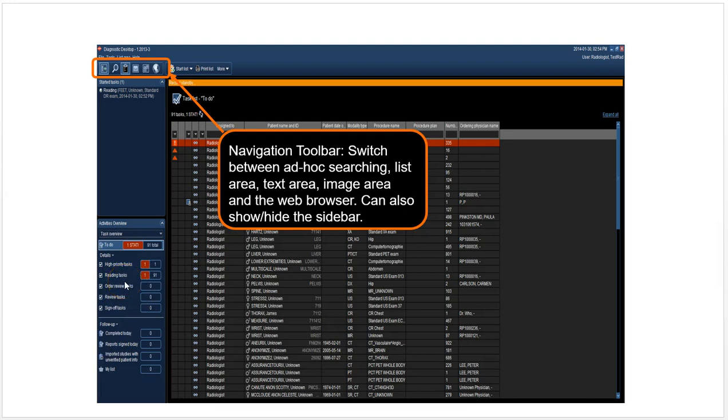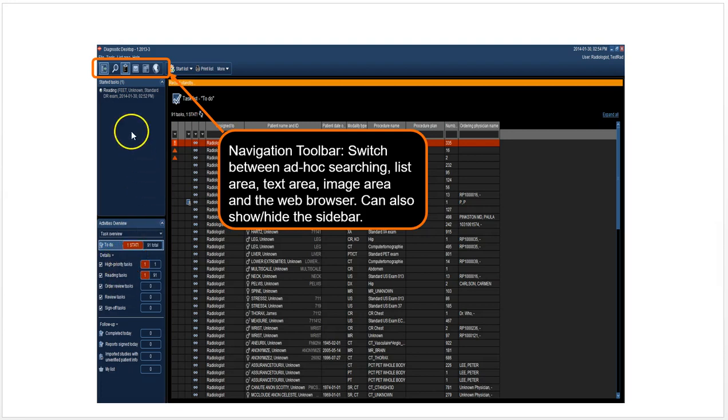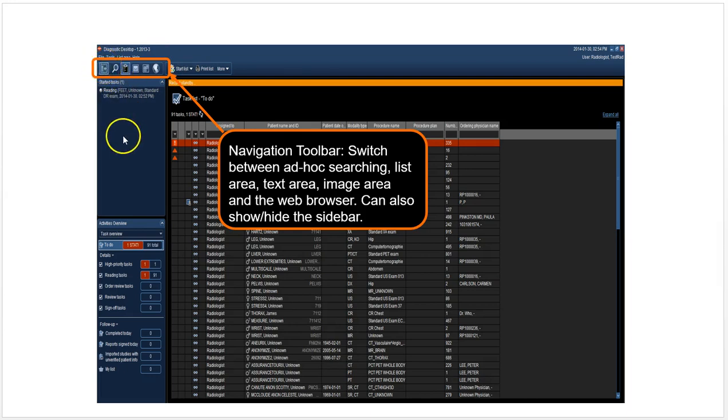You have the standard navigator with to-do tasks, and they're related to radiologists' work. You've got sign-off tasks, high-priority tasks, reading tasks. You have the standard navigation bar with collapse/expand the navigator section, search for patients, and these other functions.